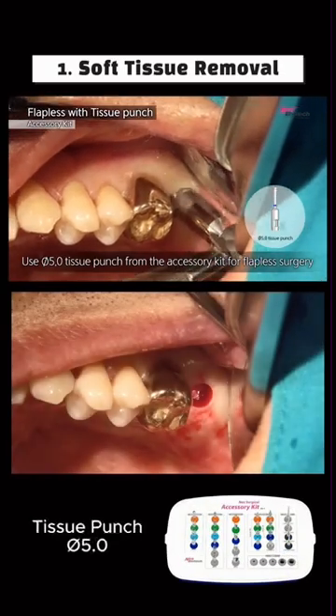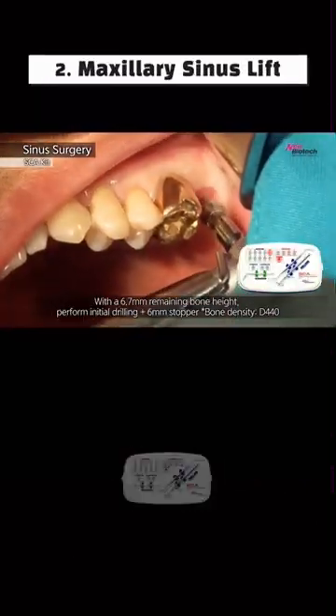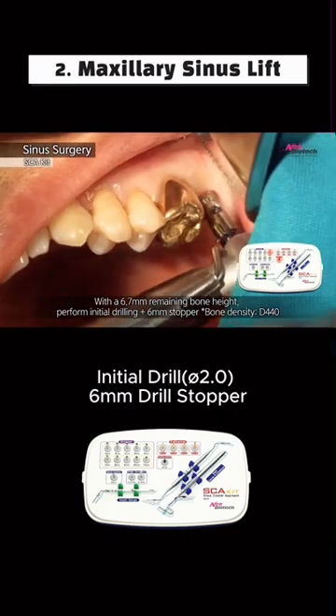First, use the G5.0 tissue punch for soft tissue removal. For the sinus lift, use the SCA kit with an initial drill G2.0 and a 6mm stopper.